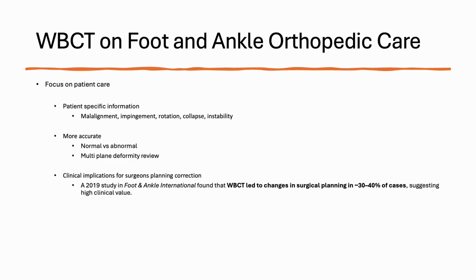I do change my plan quite often, especially on first ray, flatfoot type procedures, or bunion procedures that I'm questioning quite frequently. It's cost effective in the long term. It does cost a little bit more right away, but ultimately, like I said, you can really pay for this relatively quickly, and evidence shows it has less radiation. So all those things, it's not overly expensive.